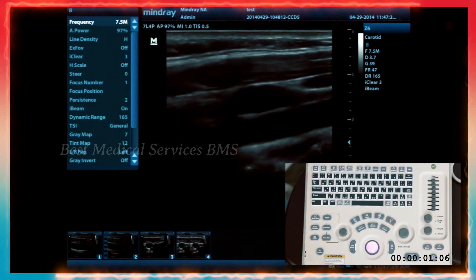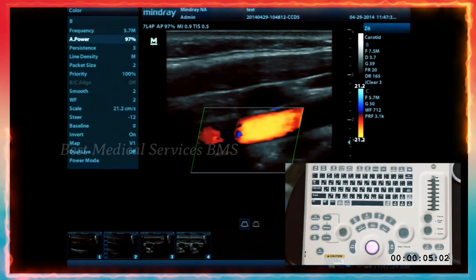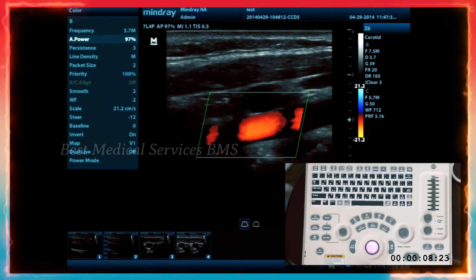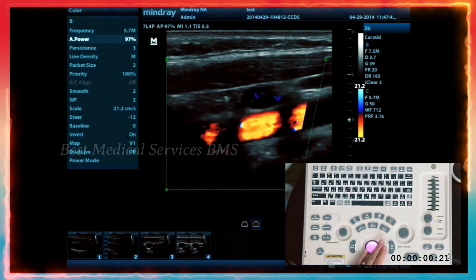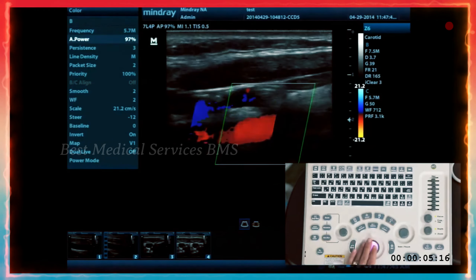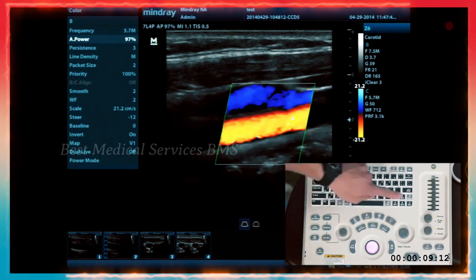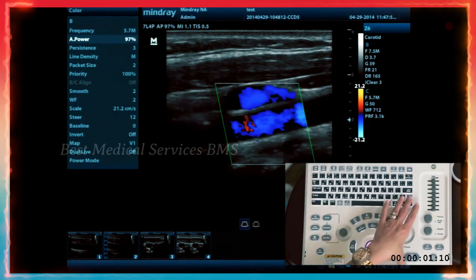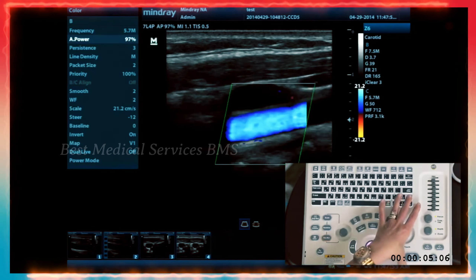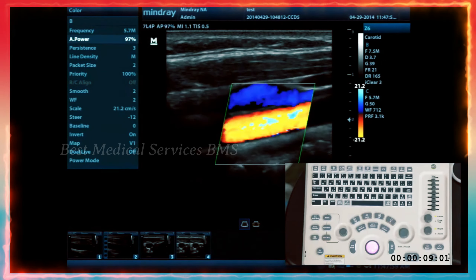Right next to B mode is your color Doppler. When you press color Doppler, it brings up your box. If you want to change your box size, hit the set button — that'll let you use the trackball to go left and right, up and down. Set then allows you to move wherever you want the color box to be. You can use the steer button for a quick steer left, right, or vertical, as well as the rotary navigation function from the menu.